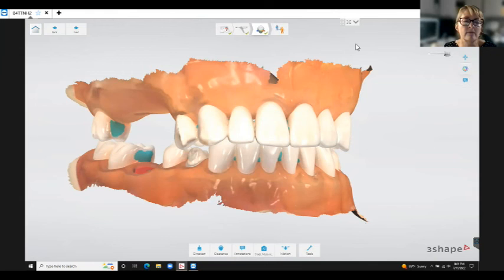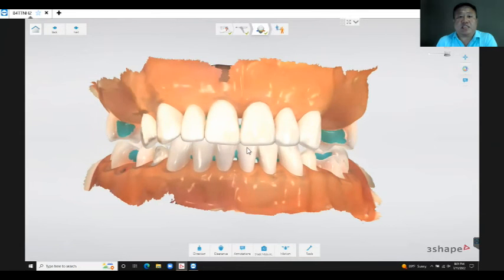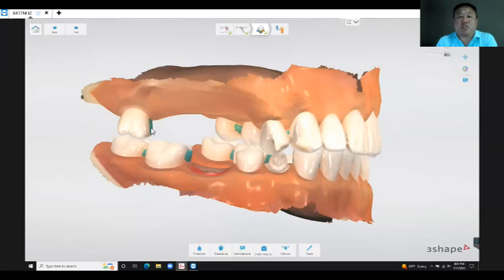Great. Did you have anything else from a scanning perspective? Just to add to it, after post-processing, if you still need to scan a specific area, like these green colors, those green colors mean they are holes, but the software was able to patch them up.